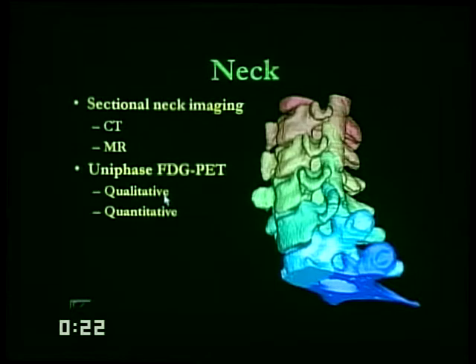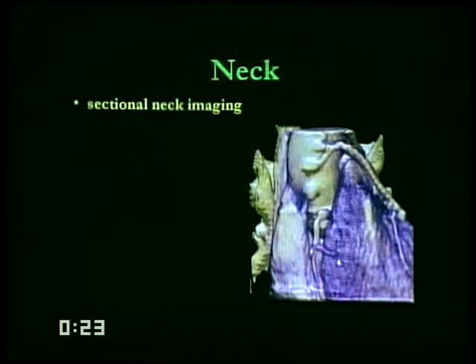At our place, we use only quantitative PET. We use standardized uptake values at all times, especially in the neck, because that's when you can be very, very specific as well as very sensitive, and that is very important.